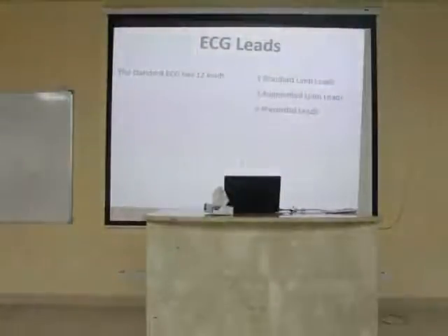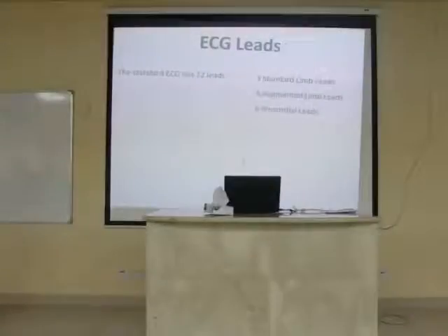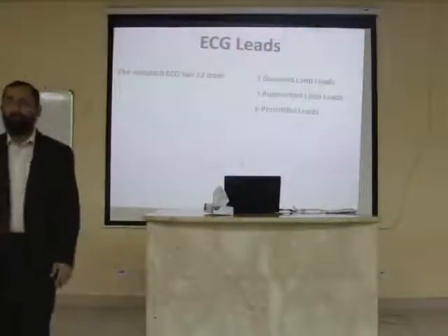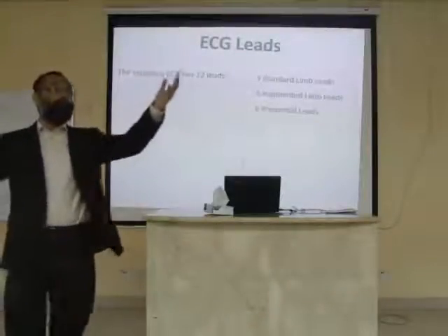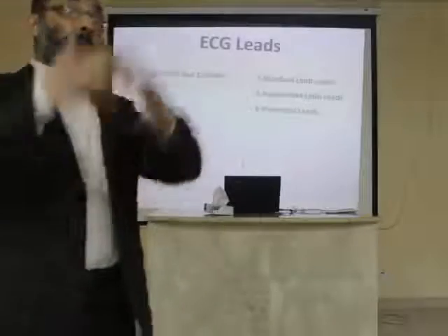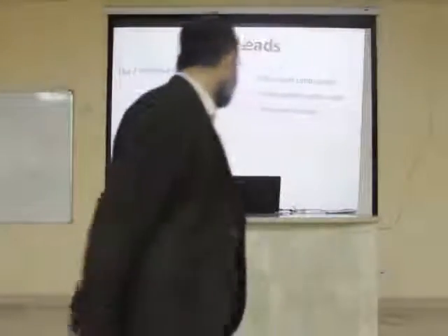3 augmented leads. Augmented. Anybody knows the meaning of the word augmented? It's an English word used in medicine and science also. Augmentation. Augmented. To augment. Very good. To strengthen or to amplify or to increase. Great. Thank you very much.